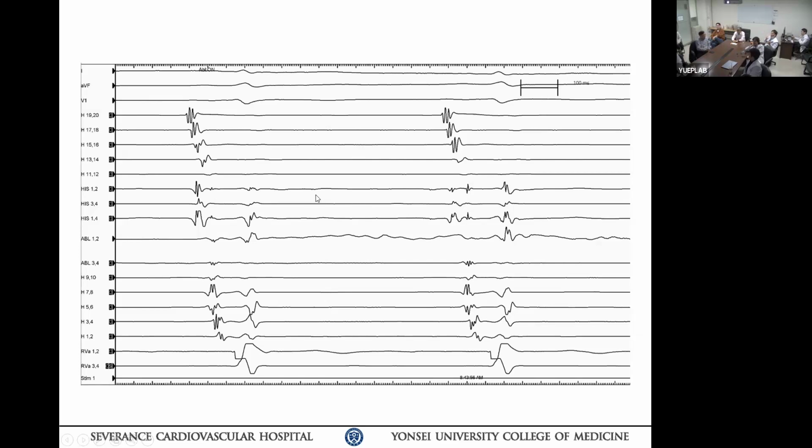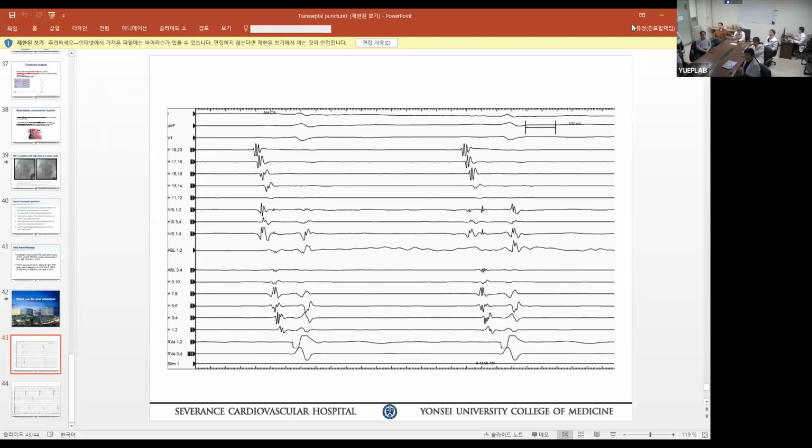Okay, very interesting. So you have X-ray imaging, I think you should see the signal just before delivering energy. I think that once you start burning, you already kill that thing, so it really doesn't help us.